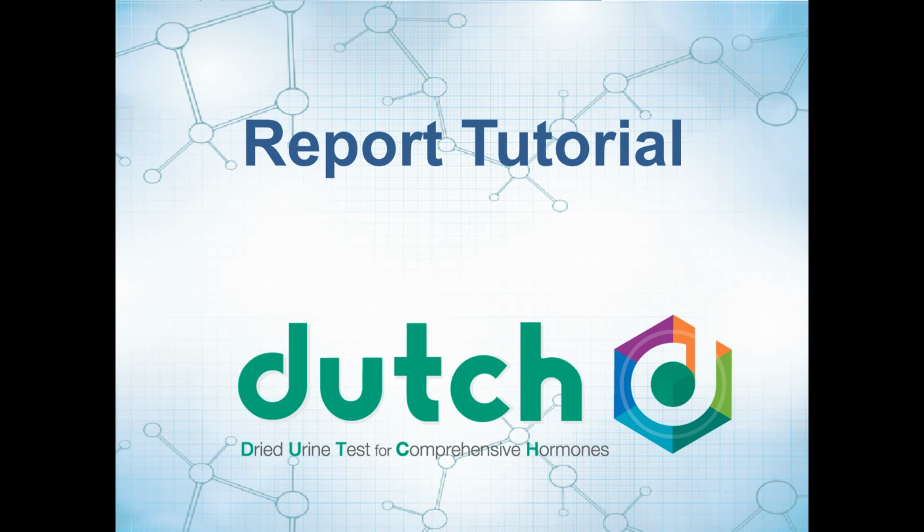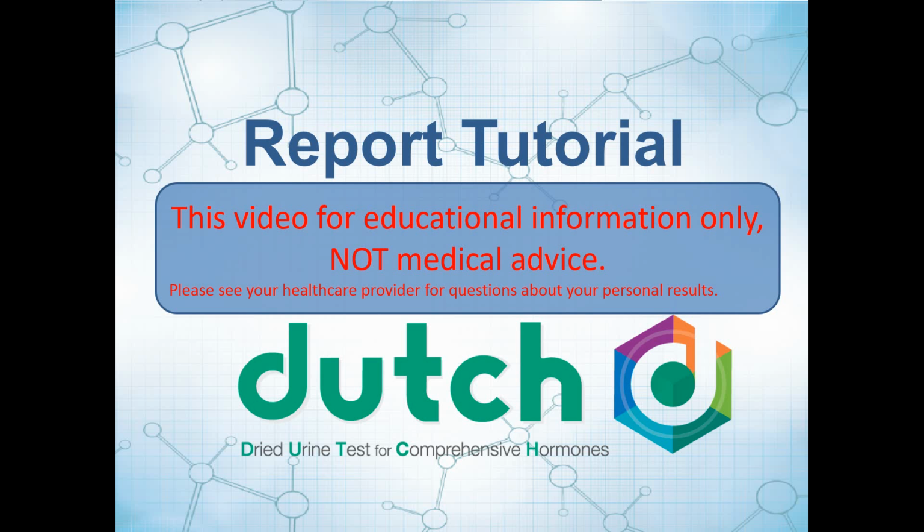This is a DUTCH testing report tutorial that's intended to help you with the understanding of your test results. These are for educational information only, not for medical advice.